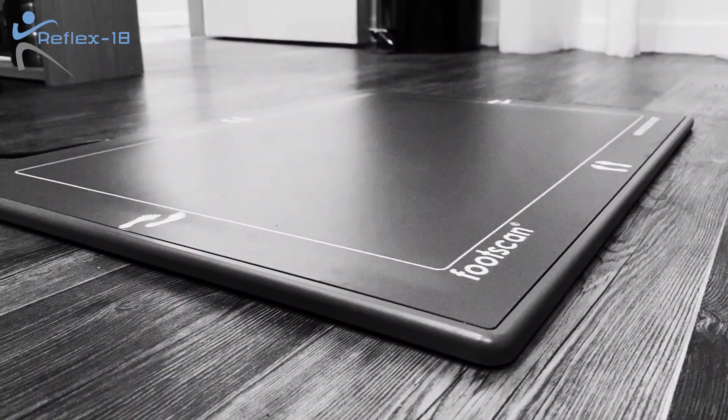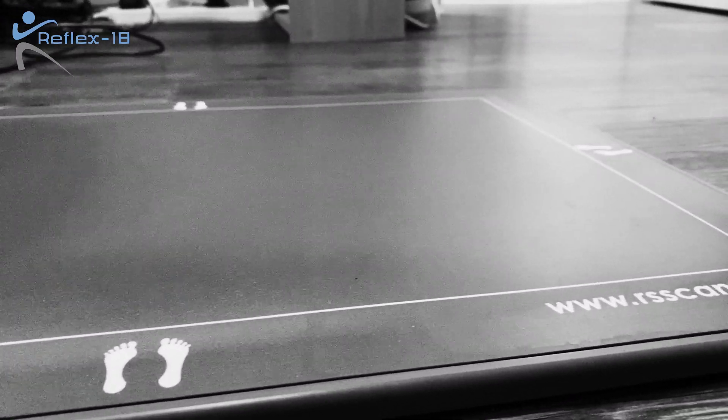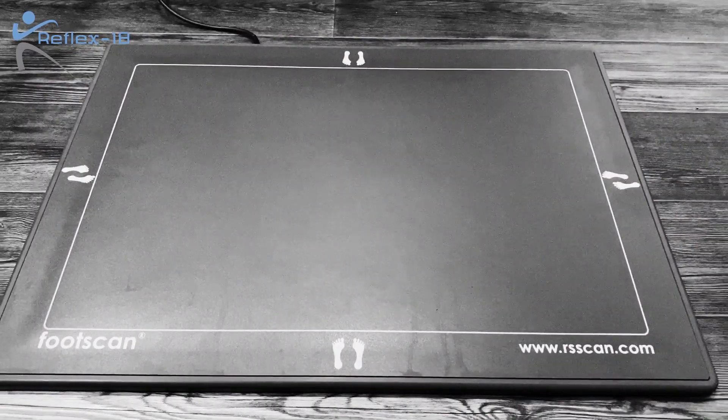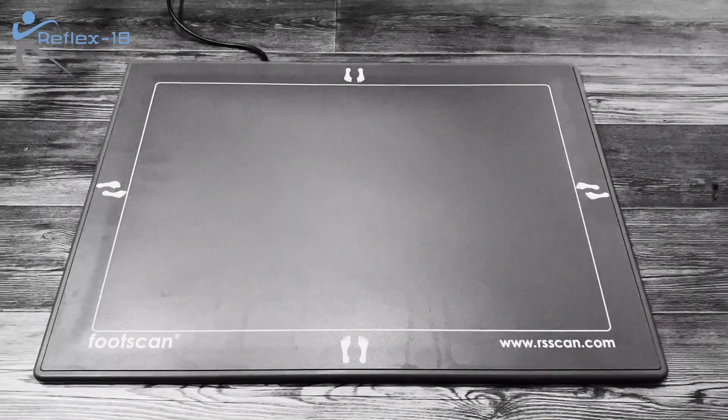The RS foot scan is a force plate that has thousands of tiny pressure sensors in it, so that when you walk over it, it measures the way that your foot moves. This then gives us data on how you stand, how you walk, and how you run.